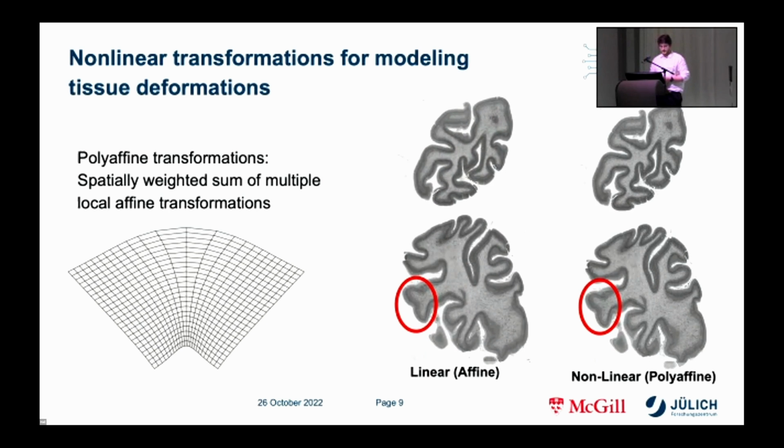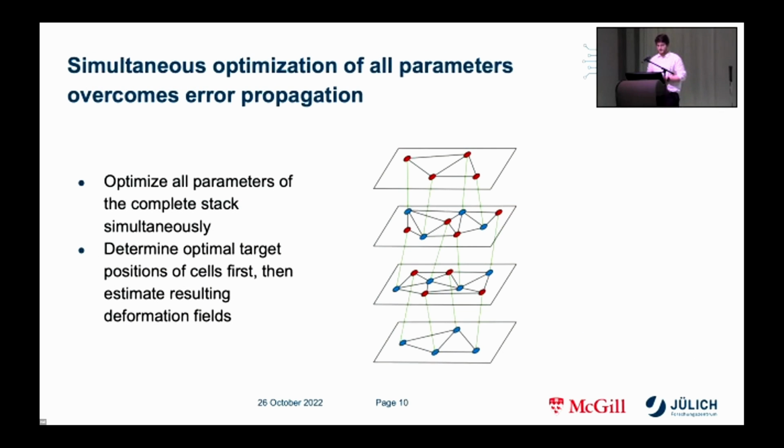And onto the section-by-section, or the error propagation problem. Instead of doing a section-by-section approach, one after the other, we chose to optimize all parameters simultaneously.